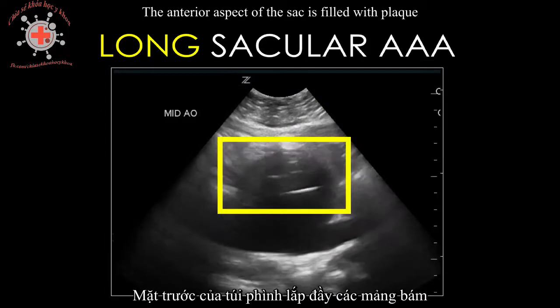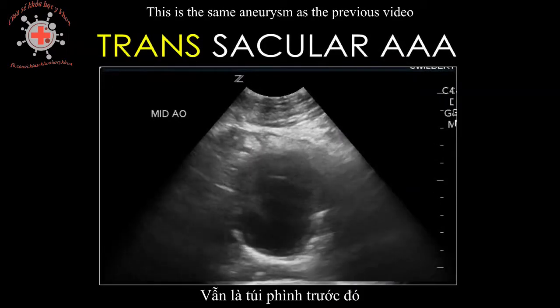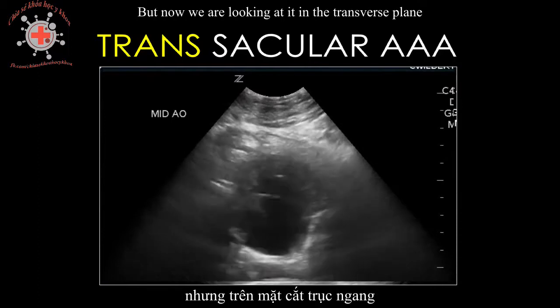The anterior aspect of the sac is filled with plaque. This is the same aneurysm as the previous video, but now we are looking at it in the transverse plane.